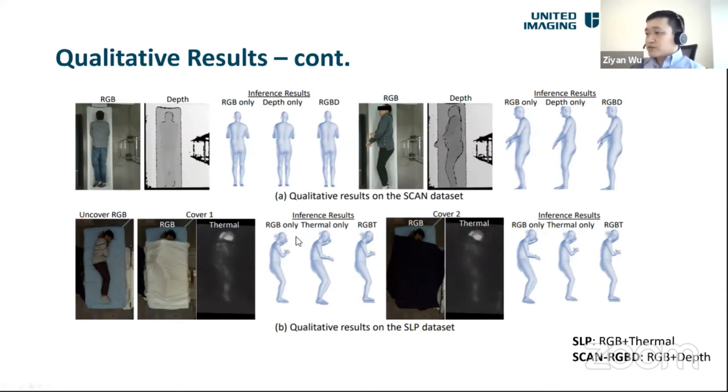And the same applies to the thermal data, RGB plus thermal data. In this case, even when the patient is covered in a blanket, we can precisely recover the pose of the patient under the cover.